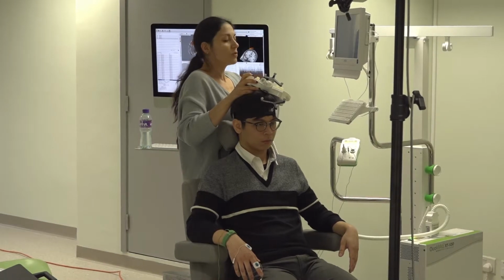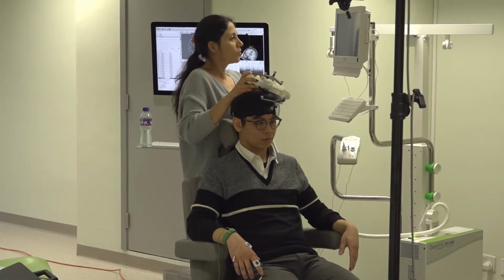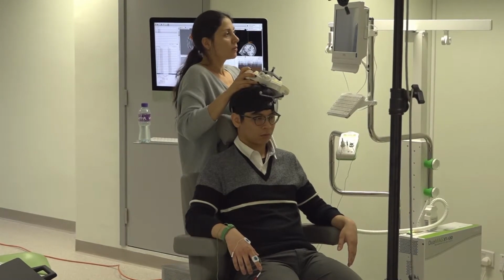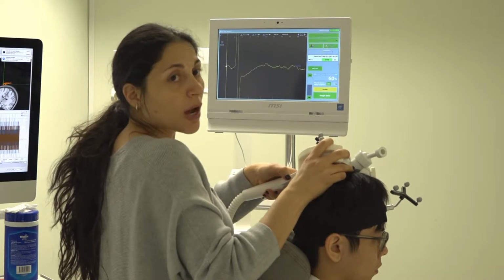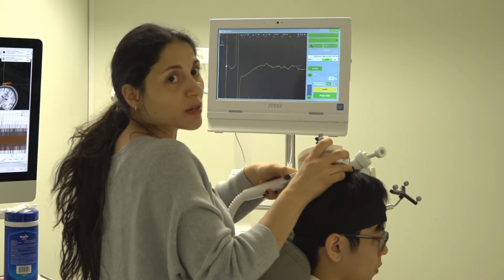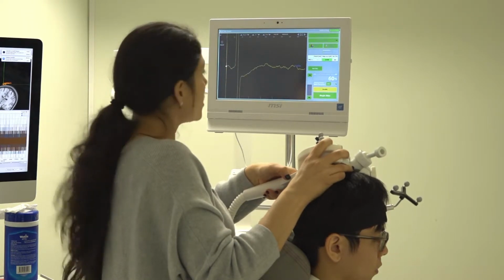Okay, 64 is too high. 2, 3 is too high. So I go low. Do you see what I'm doing? I'm starting to find the intensity I need to evoke a 50 microvolt peak to peak motor evoked potential.